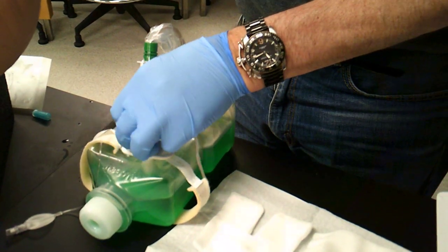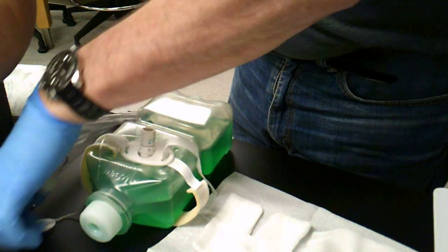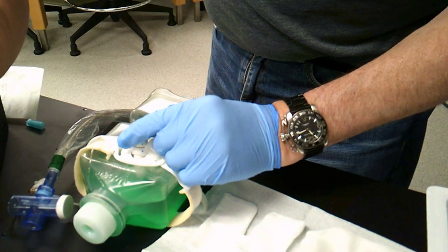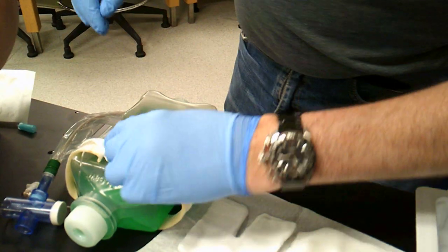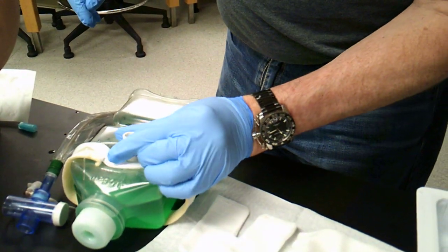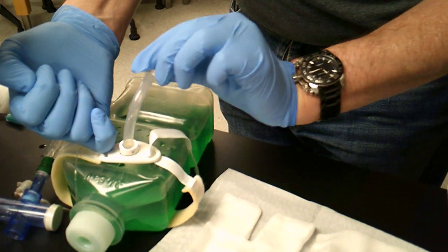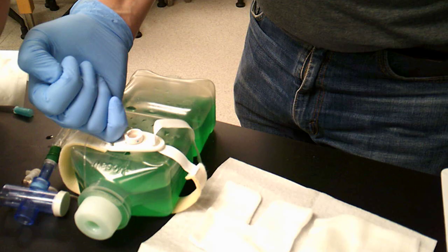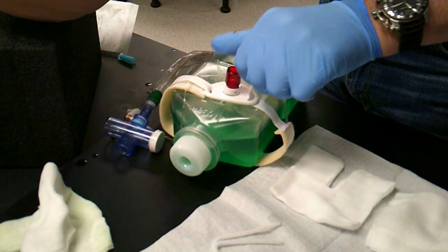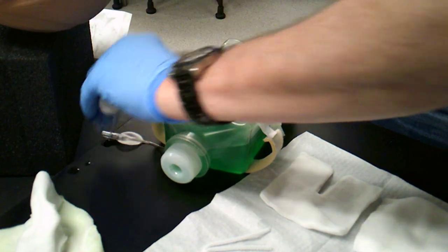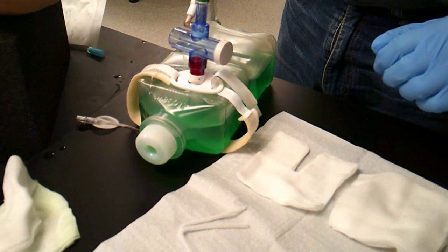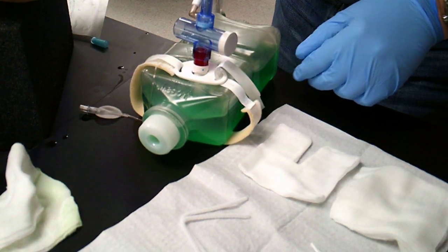Then I want to go ahead and remove my inner cannula. Now, on the Shiley trach, there's a locking mechanism that is there. So, you just turn it. And we can go ahead and let that clean. And we will have a spare inner cannula that we will have. So, now the patient can be ventilated again.